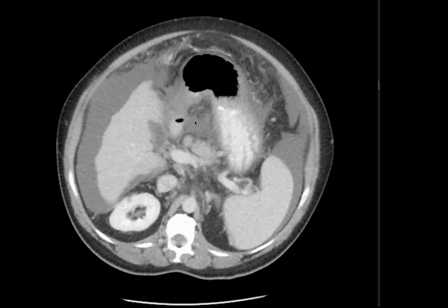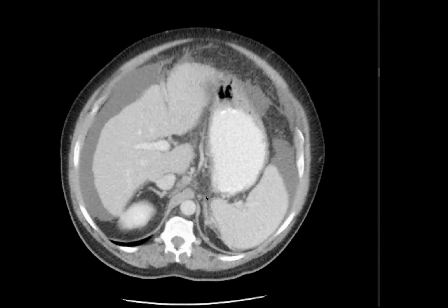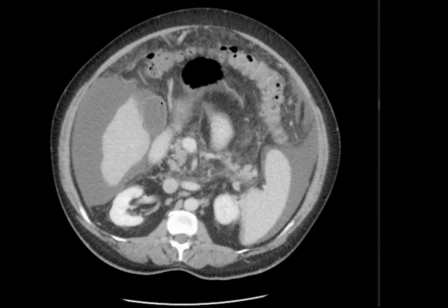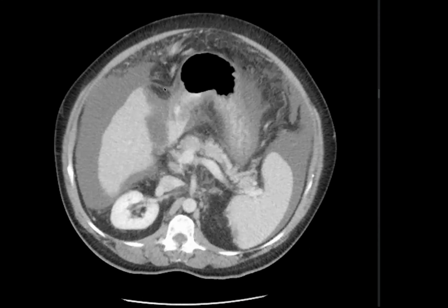First of all, I want you to be very careful with the terms you use. Try and be as general as possible at the beginning of your case and less specific. So you said omental caking. When you say omental caking, that implies soft tissue infiltration, nodular thickening. But then when I asked you to show me, you revised your opinion and said it's probably mesenteric edema or omental edema. This is what it is, it's edema. So be very careful with words you say because they have implications. And if nothing else, the examiners will challenge you.